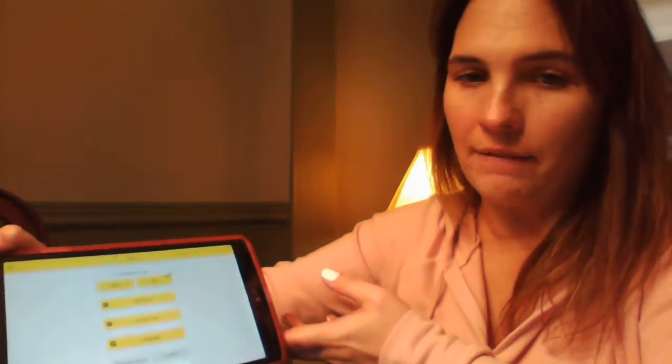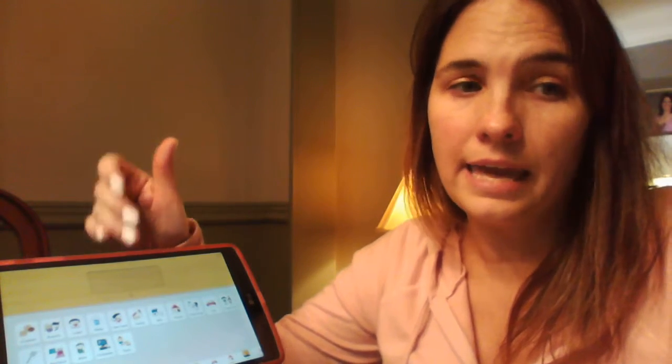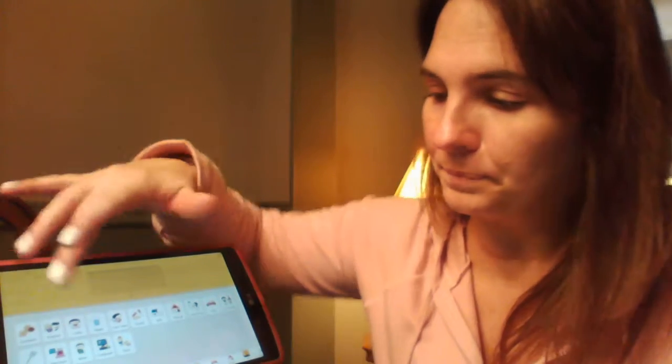The cool thing about having to wait for that little clock to show up in order to change the settings is that the student using this device can't accidentally get in there and delete some of the cards that are uploaded or some of the things they use most often, and then they get frustrated when they can't find them because they were accidentally deleted. Maybe the person doesn't know they were deleted. So it's good that they have to wait, because the odds of a student holding it long enough to get into that section are probably pretty slim.